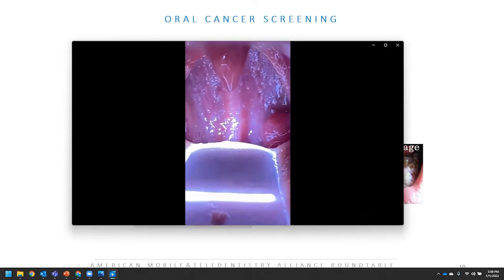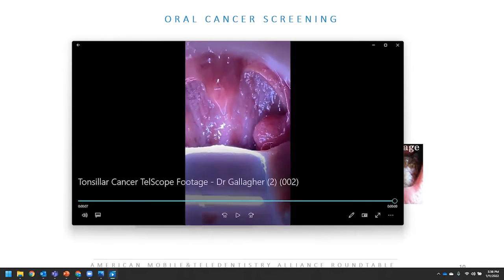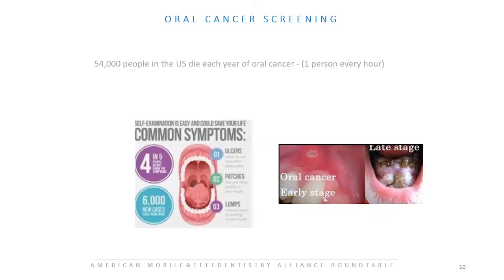So in Florida, we're supervised by a dentist. So I'm passing all the information from my assessment on to my dentist for him to be able to diagnose, but it'll just give more visual for him to view a video instead of individual captures. So I'm very excited about that.